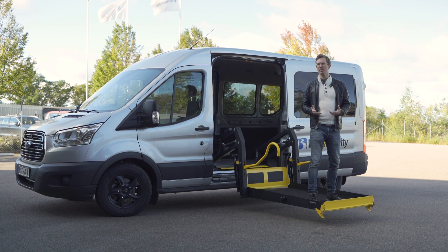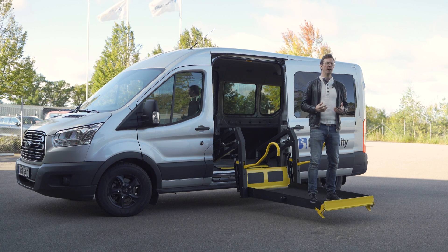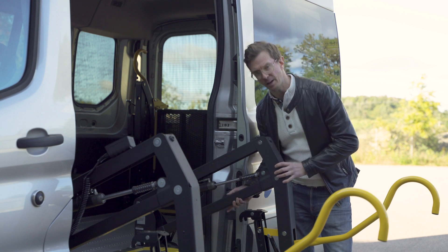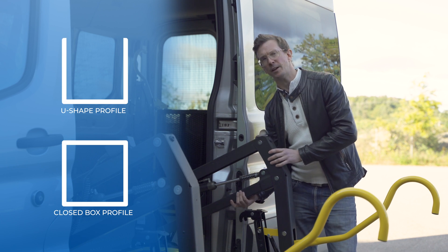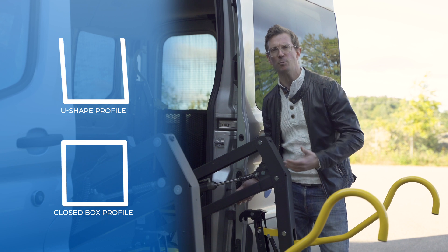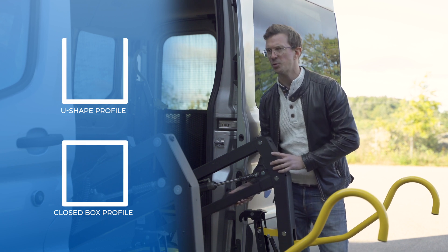Unfortunately, it is very hard to demonstrate this in a video, but rest assured this is something you'll notice when you ride up and down on the platform. This is what enables the increase in rigidity. Most other wheelchair lifts of this design use a U-shaped profile here instead, and unfortunately they are much more susceptible to skewing and deflection motions. Our closed box design handles this much, much better.